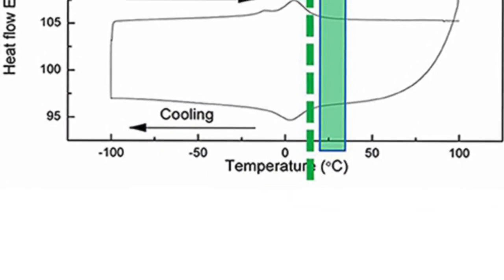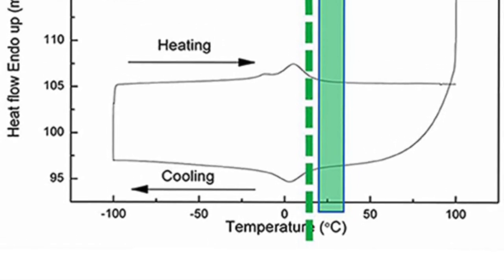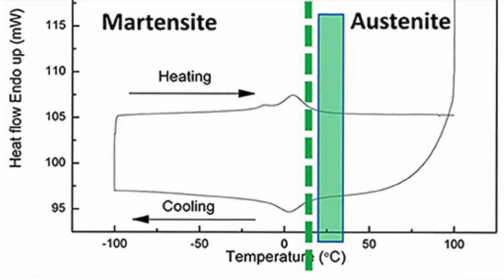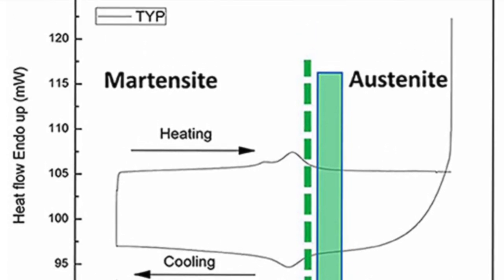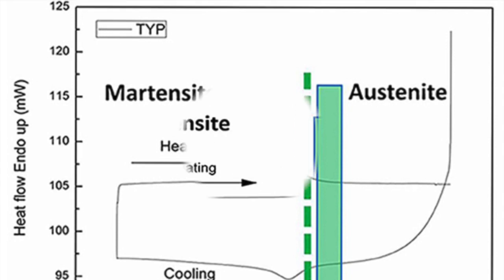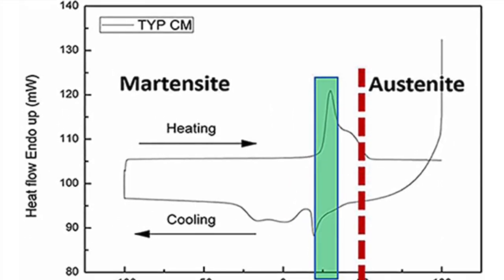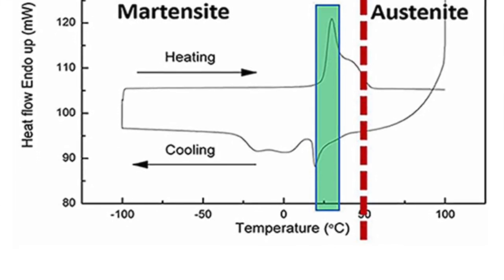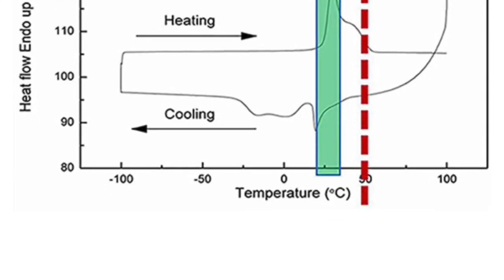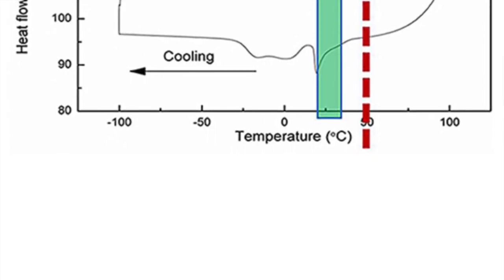At the beginning of 2000, a series of studies found that changes in the transformation behavior via heat treatment were effective in increasing the flexibility of nickel-titanium endodontic instruments. Several thermomechanical processing techniques have been established with the goal of creating super-elastic nickel-titanium wire blanks that contain the significant stable martensite phase in a clinical condition.